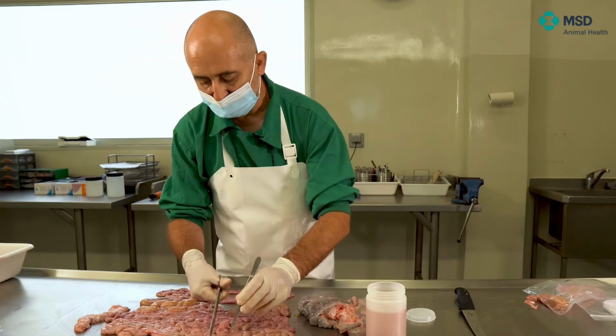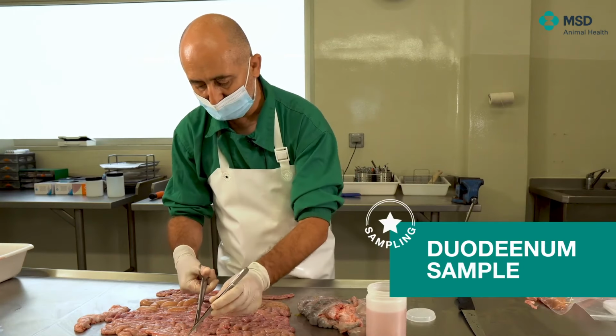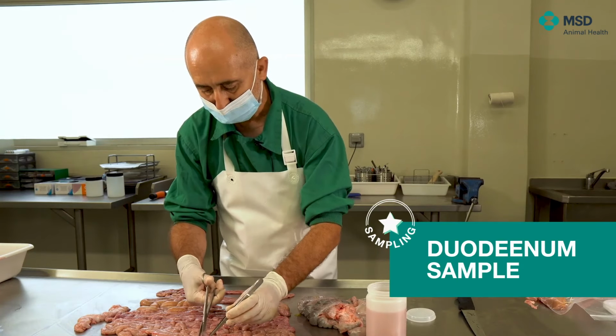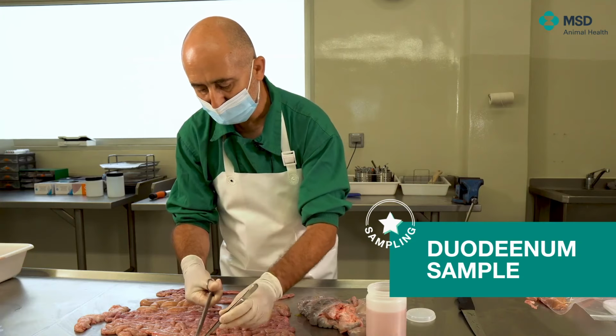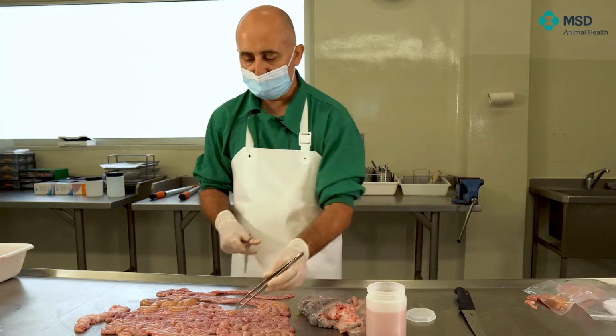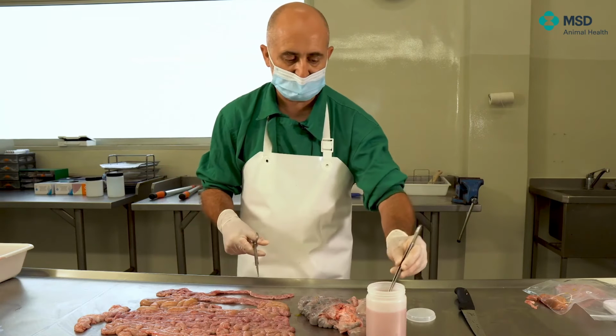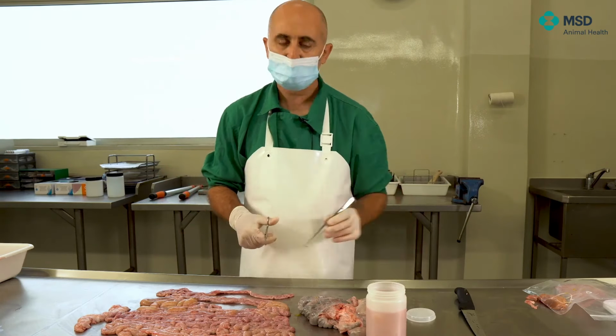And finally, here we know that this is duodenum, so we can take also a small piece that we will cut as well in a longitudinal manner, and we will put into formalin. Remember that the sensitive part is the mucosa. This is what we need to analyze from a histopathological point of view.